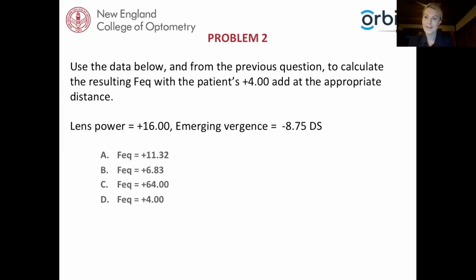So this question really does require a couple of steps. First, we're calculating what that enlargement ratio is. And then we have to consider the near addition.